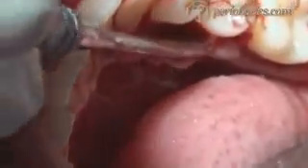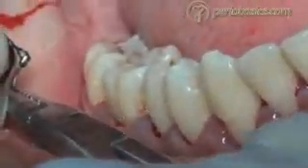The same thing is done on the lingual aspect. Inspection is done and seen whether any granulation tissue or tissue tags are remaining. So all these are removed, and then we go ahead with the suturing procedure.